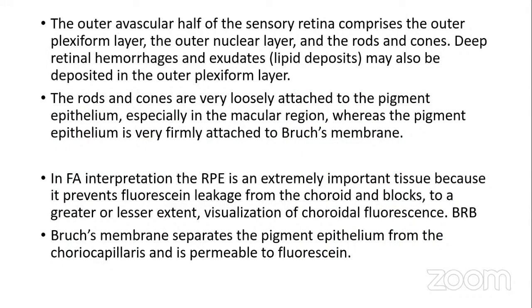Then you start seeing the vascular fluorescence that starts with the retinal artery, which starts filling 1 to 3 seconds after the onset of the background hyperfluorescence. So we talked about that. From the arteries, we get to the arterioles, you cross to the venous, and you see the veins filling.